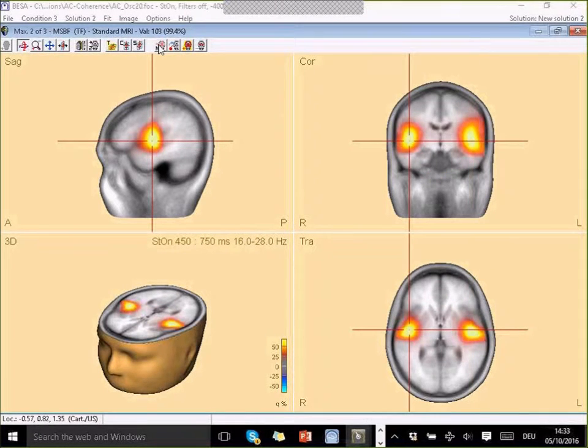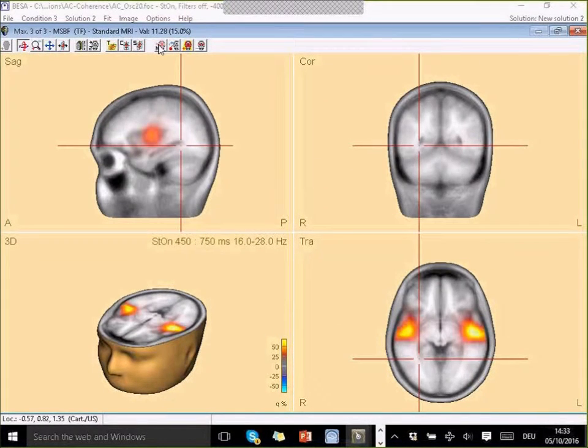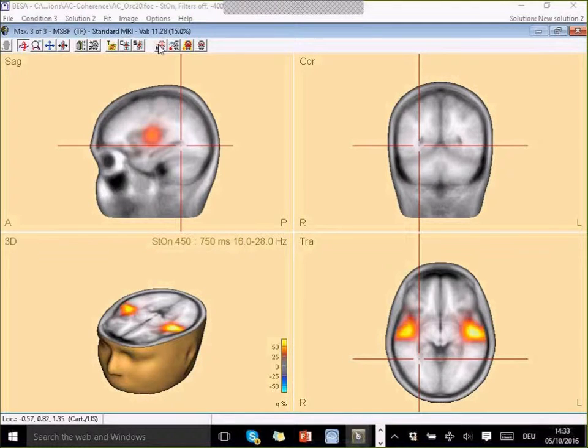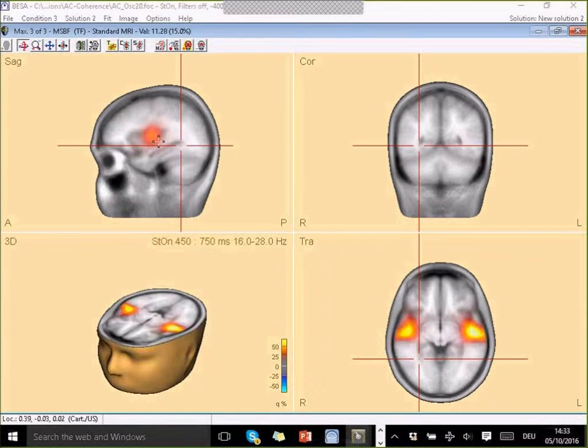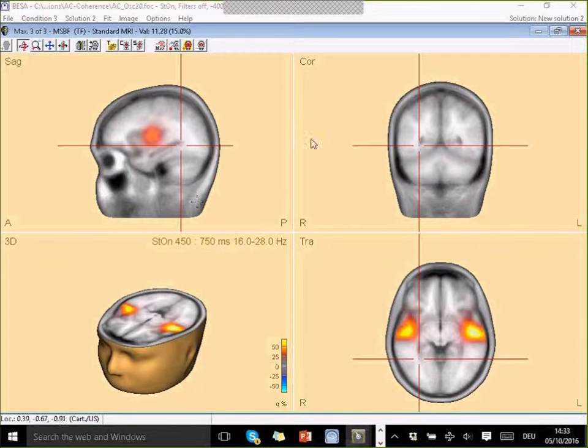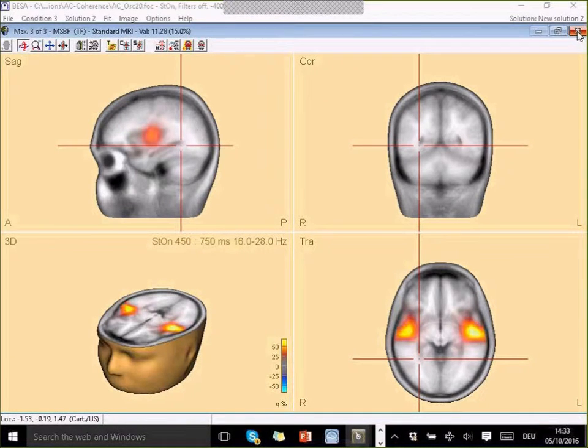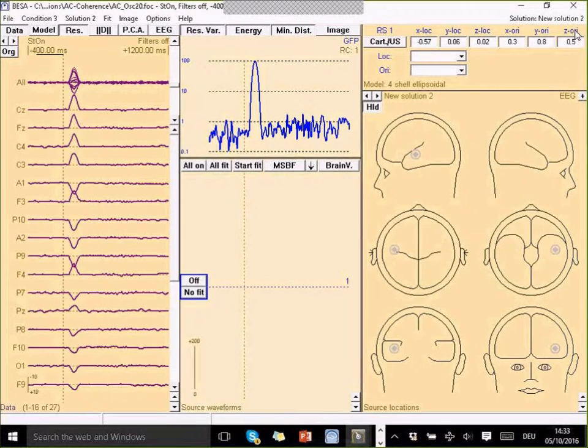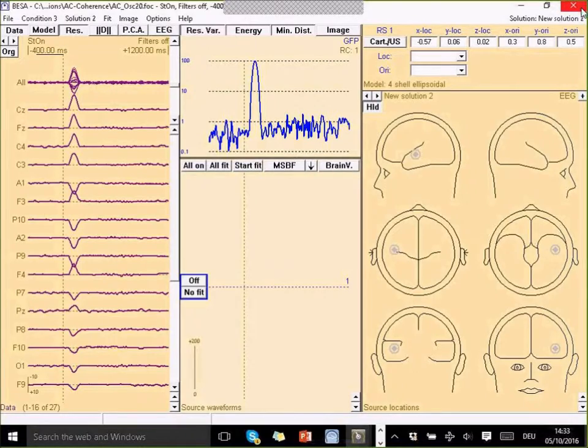I can see the two maxima very nicely activated around about where my sources were simulated. And the third maximum is very small, so it's negligible here.